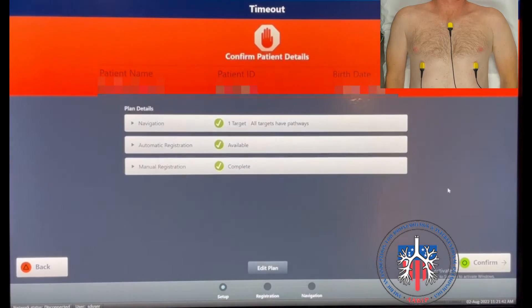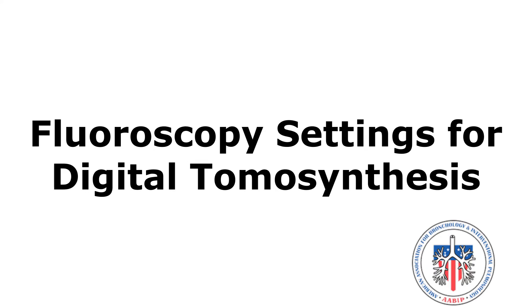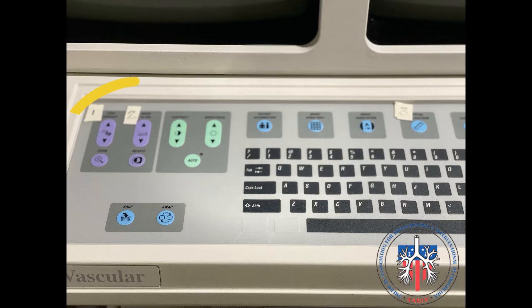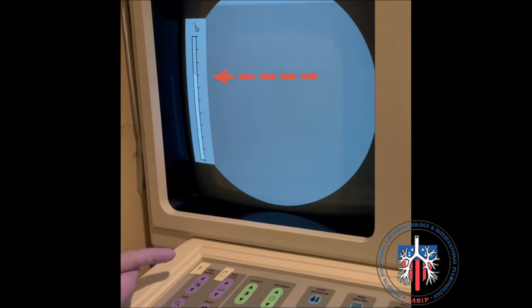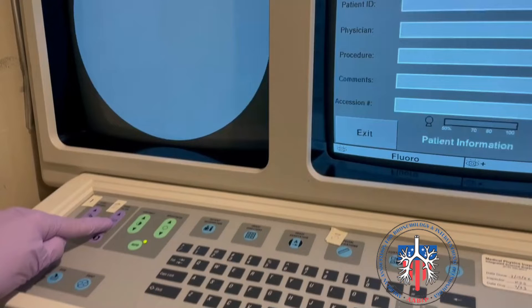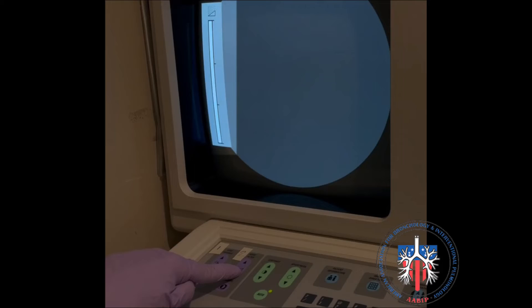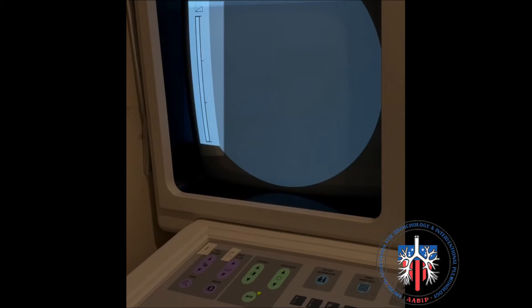The screen is advanced and the patient details are confirmed. Fluoroscopy settings for digital tomosynthesis — this example is with the GE 9800 C-arm. These two buttons represent edge enhancement and noise filter. First, press the edge enhancement button; edge enhancement should be at the seventh dash as shown. Next, press the noise filter button; the noise filter should be set to zero. In this image the noise filter is set at maximum; here it is set to zero.